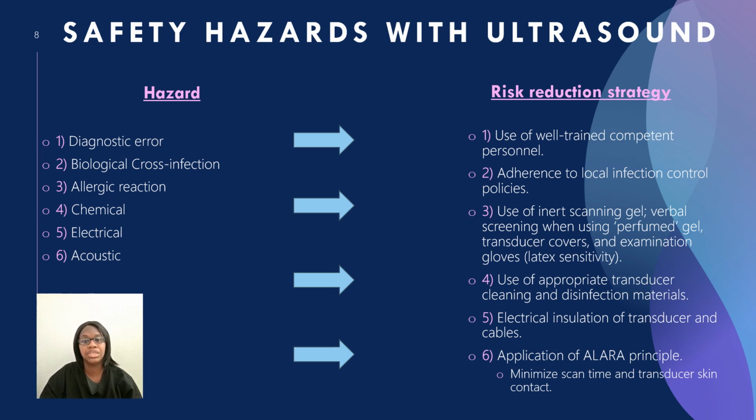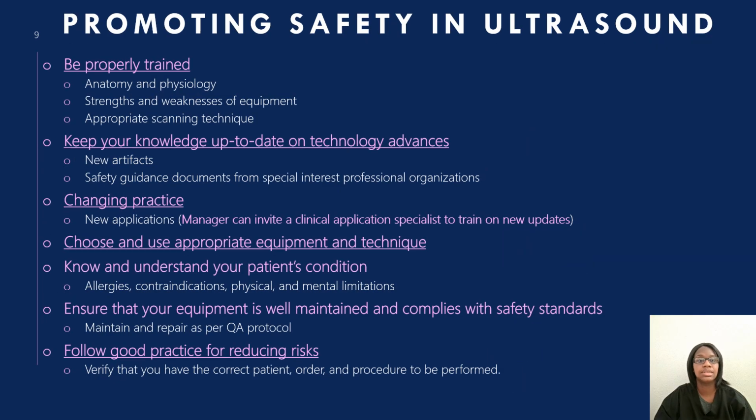Electrical, make sure that the cables and the coils and the wires are intact. It doesn't have any type of cuts or strips in the wires. And for acoustic, just make sure that you are minimizing that scan time and the contact with the transducer on the patient's breast. So this is a way we can promote safety in ultrasound.